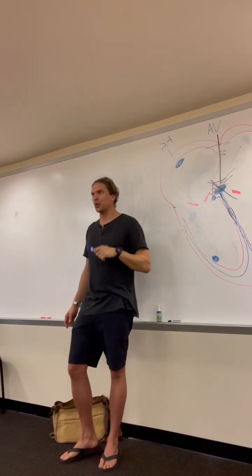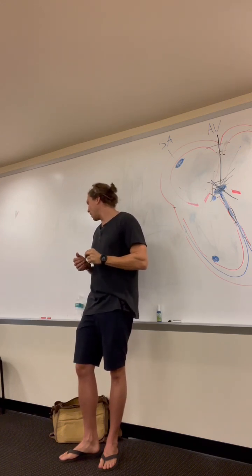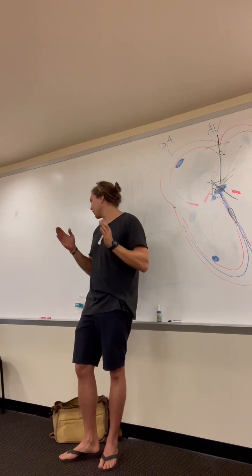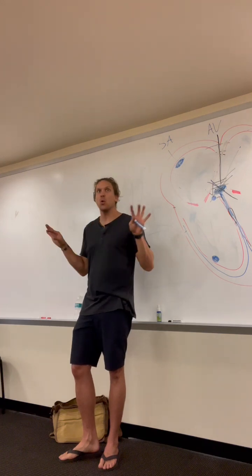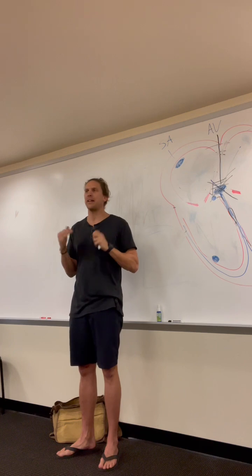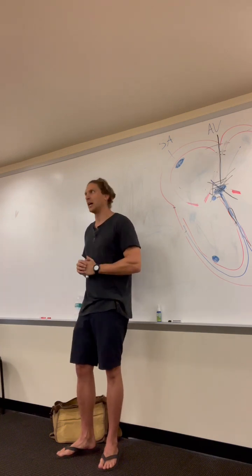So those are your clues that it's maybe a 3rd degree heart block. And then intervals, there is a PR interval, but it keeps changing. By now you should have figured out it was a 3rd degree heart block, no association whatsoever, and then just confirm with that paper method. That's what I always use on my dysrhythmia tests.